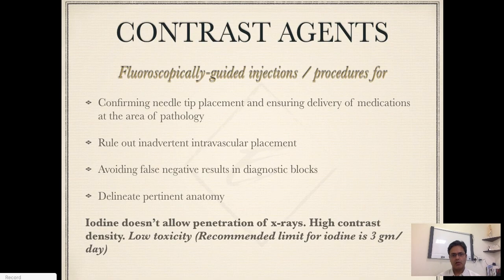So as we all know the reasons why we use contrast. Common ones being we want to make sure where the needle tip is, we want to make sure that the medications we're giving are delivered in the right area, we want to make sure there's no intravascular uptake, especially if you're doing things like medial branch blocks, where you're giving a very tiny amount of medication. If that's going intravascular, then you will get a false negative result, which is going to have a bearing on your future procedures.